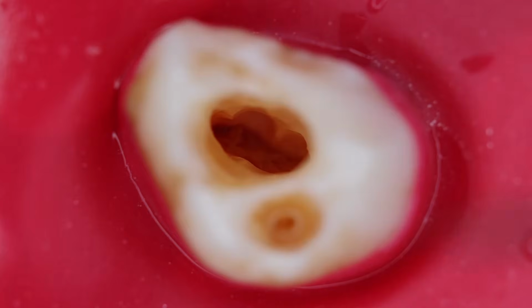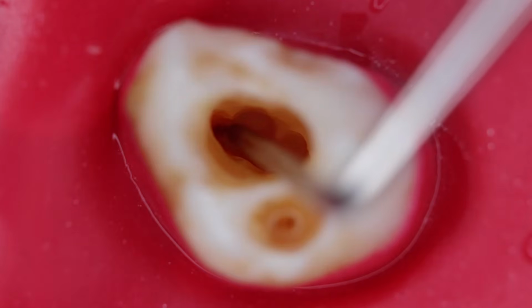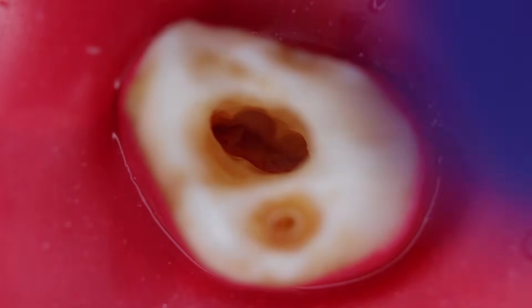And you are able to identify the second canal. As you have enlarged it, this is the mesobuccal canal, and over here, just at the junction more mesially, as you can see, there is an opening. Let us explore whether this is a mesobuccal 1 or the MB2 canal.